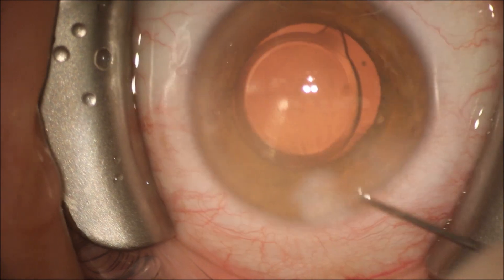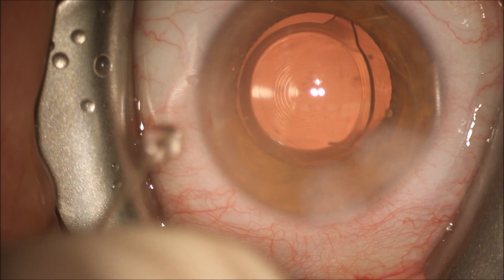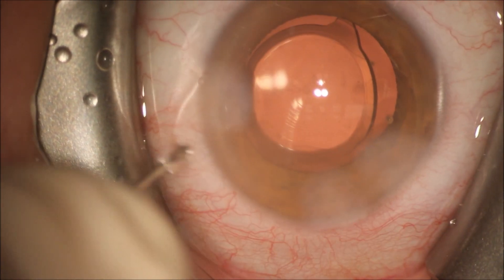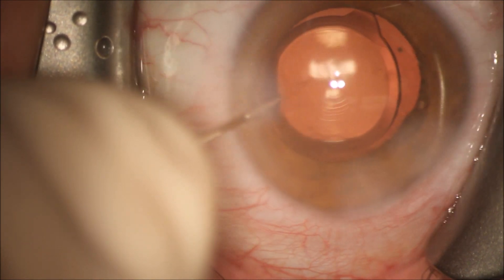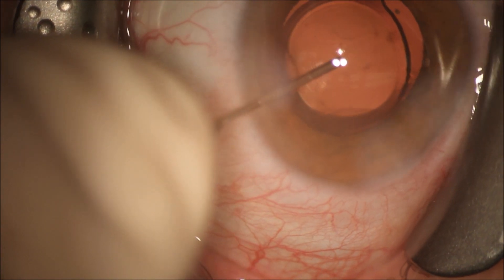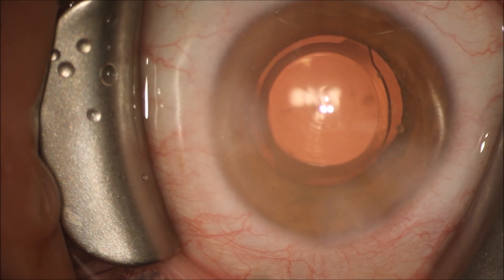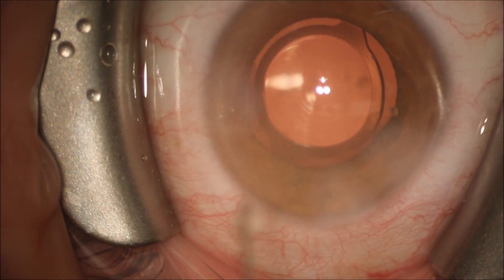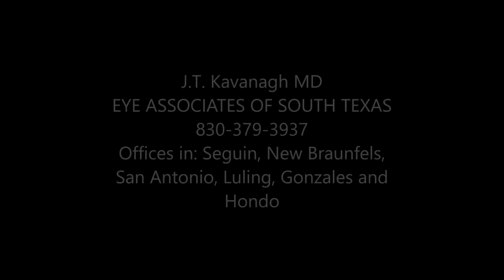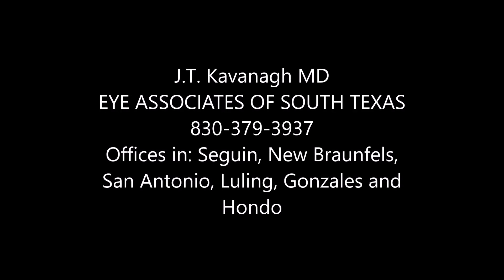We're now going to get the patient to direct their attention to the three lights on the microscope and look right in between all three of those bright dots on the cornea. This will help us center this intraocular lens using the 27-gauge cannula. Once the patient is fixated on these three light sources, we make sure the lens is well-centered. In this case, you can see the three microscope lights were right on the pupillary axis and at the center of the intraocular lens.